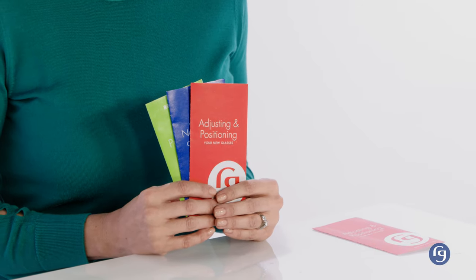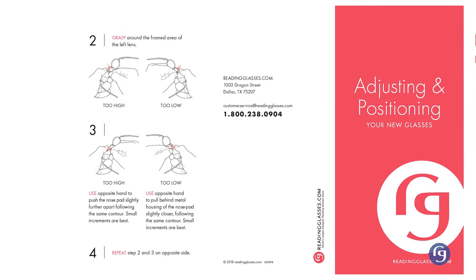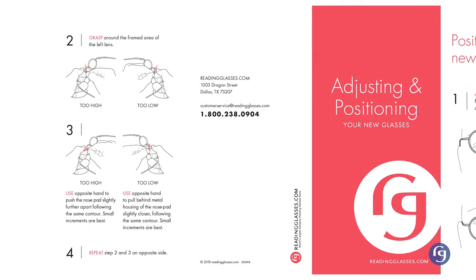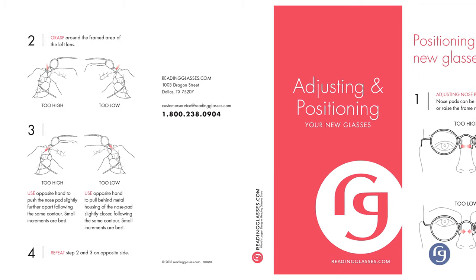And now you have them in your anxious little hands. Accompanying your glasses, you'll find some information pamphlets, some general in nature and others more specific to the style and model you chose. These pamphlets contain some great information. Adjusting and positioning your new glasses can make them fit like they were custom made for you. It can also be a lifesaver when you fall asleep reading and need to readjust your frames back to normal — I'm speaking from experience on that one.